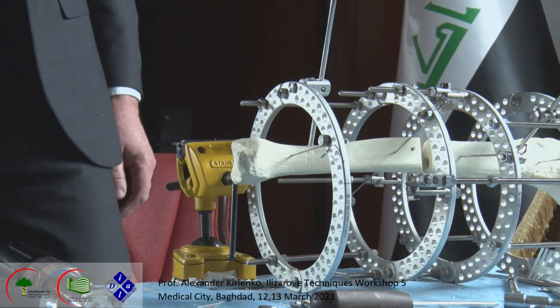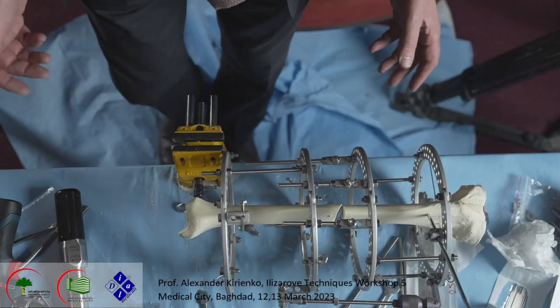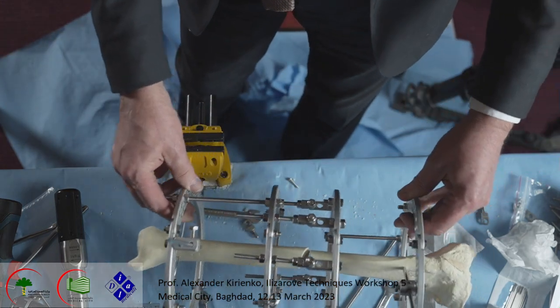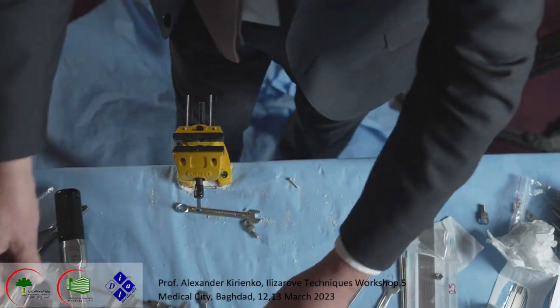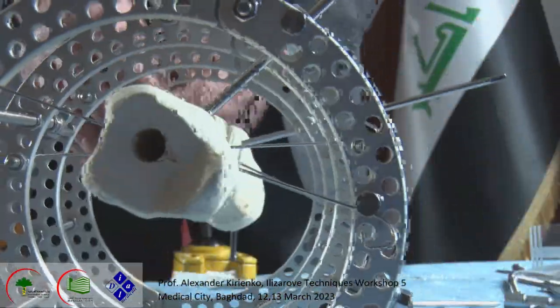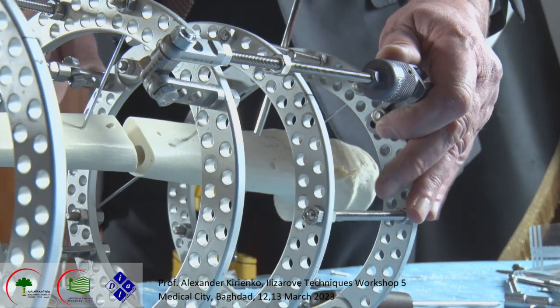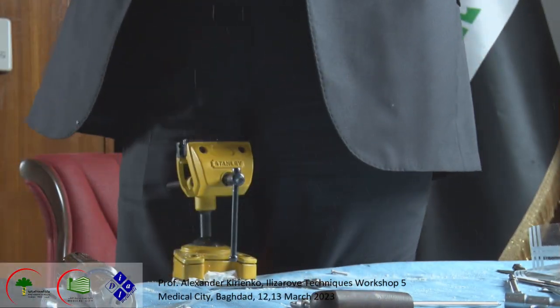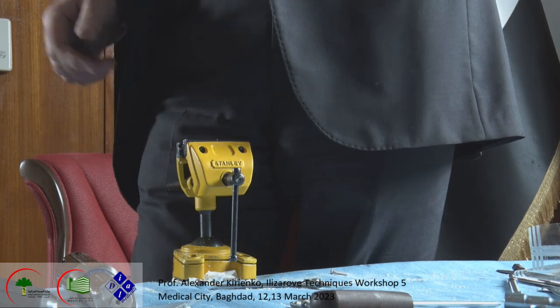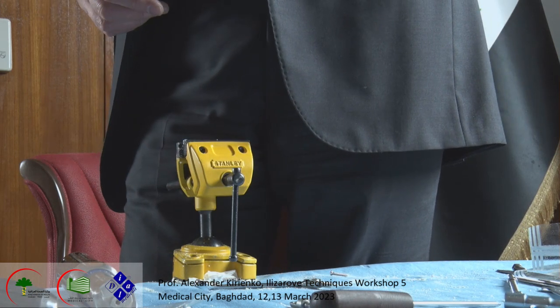Okay. If you want, we are not so many people, come here, we see together live how it functions. If you want to touch it, if you want to rotate it, and this is now, you see, completely straight with a good regenerated bone inside. Okay?